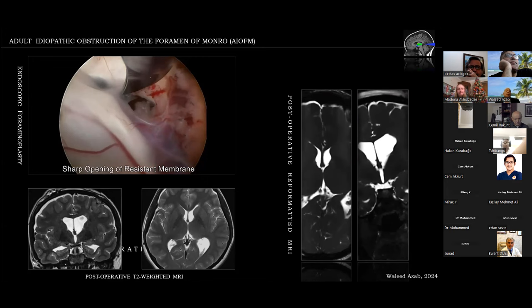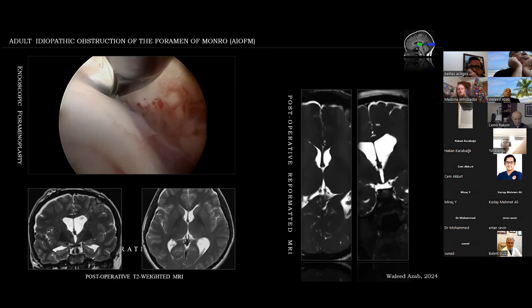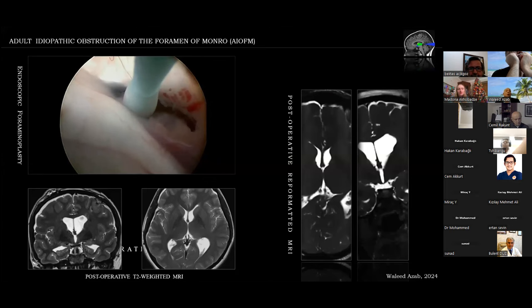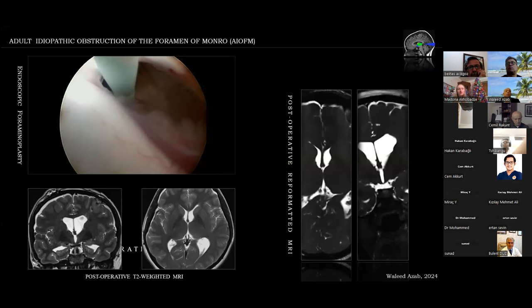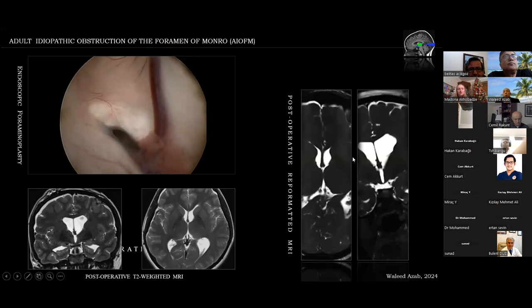Sharp opening of parts of the membrane was performed, and then a final enlargement with the Fogarty balloon catheter again to complete the foramenoplasty.